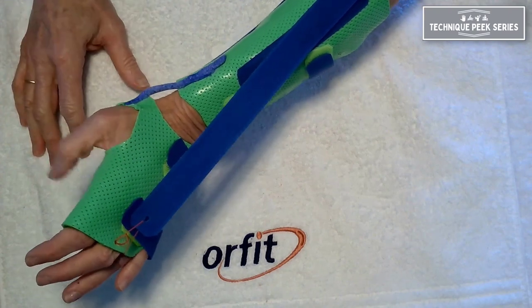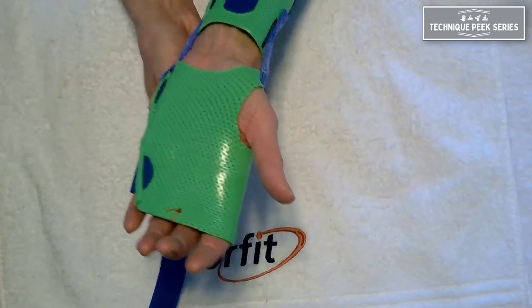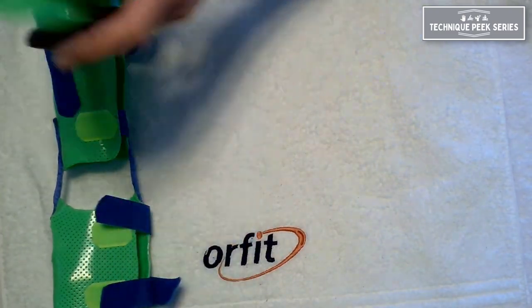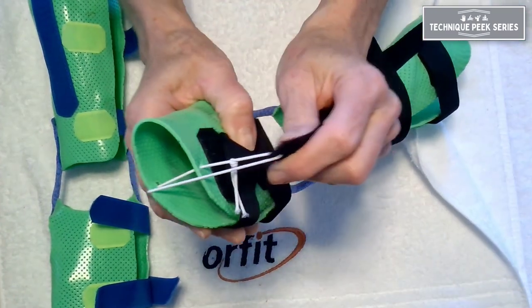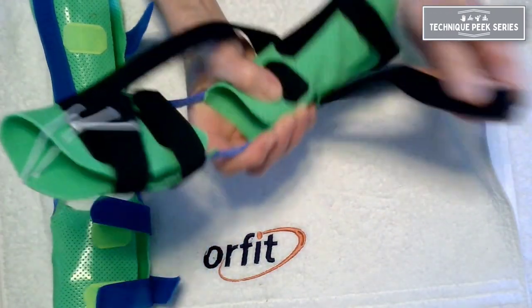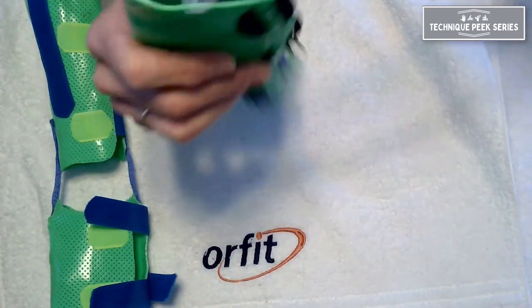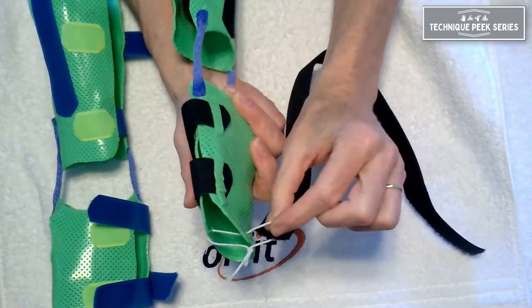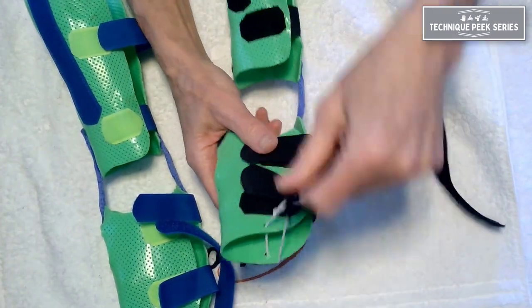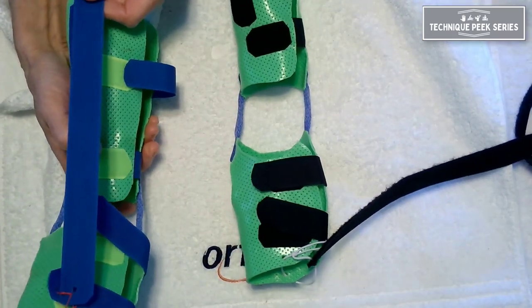The thumb doesn't need a whole lot of range of motion because it's not a functional orthosis. By adding a little bit of elastic thread to connect your velcro loop, you can create a dynamic pull — the same orthosis, same design, but with a dynamic pull into flexion or extension. So you could give your patient two options: elastic thread for a dynamic pull, which typically requires a longer wearing schedule, or non-elastic thread for a static progressive pull, which can be adjusted throughout the day.